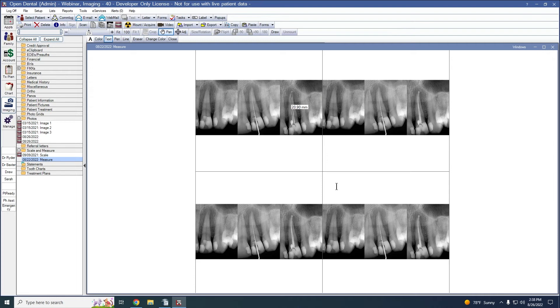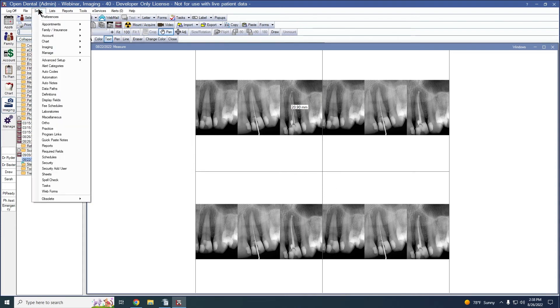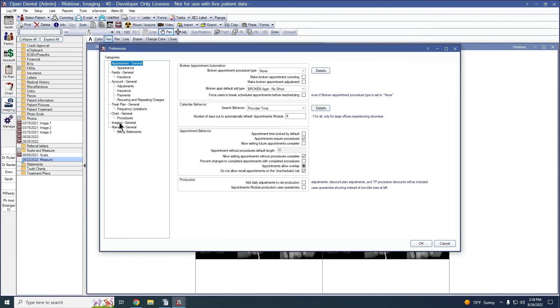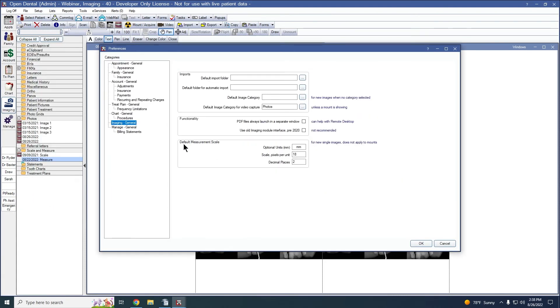We can also set a default scale for use with single images — meaning images that are not attached to a mount. To do this, go to Setup, Preferences, and down to Imaging General. Here, we can set a default measurement scale, including our decimal places and our optional units. This will be the default scale used on individual images.